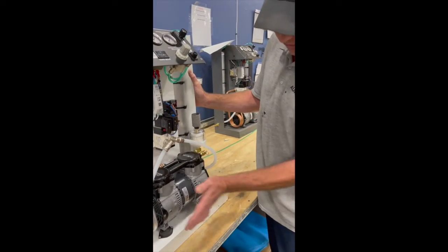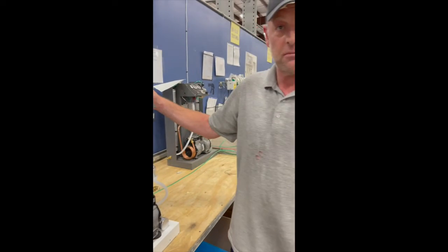We have cooling fans inside to keep the compressor cool. And that's pretty much it — maintenance free.